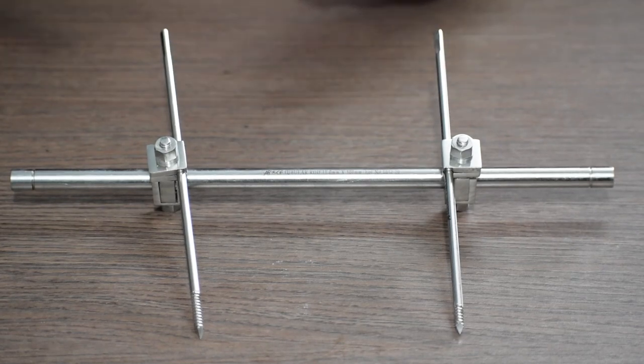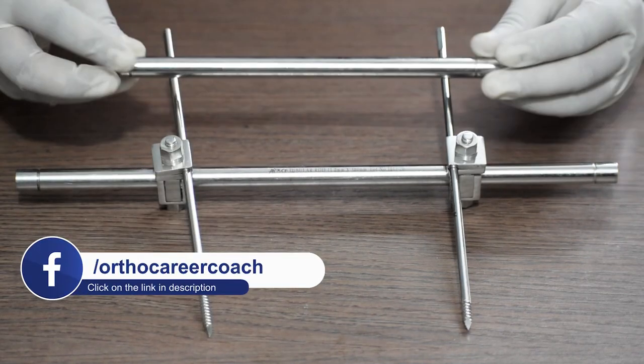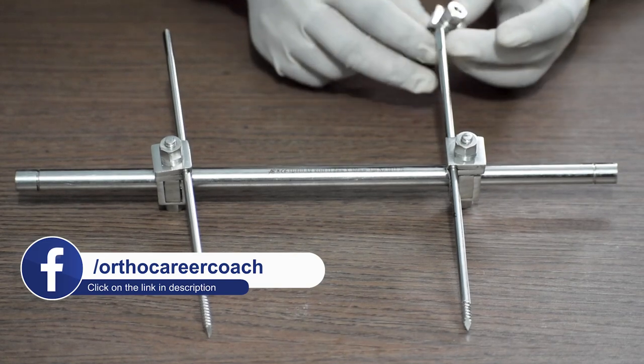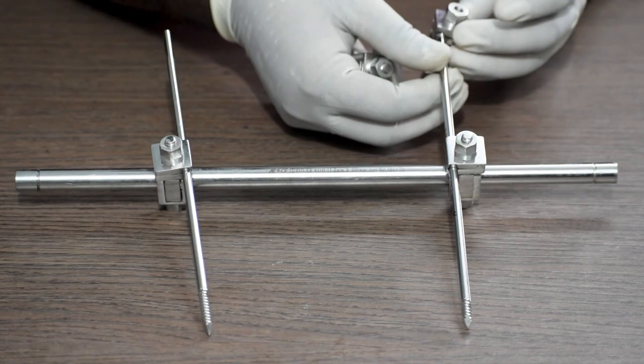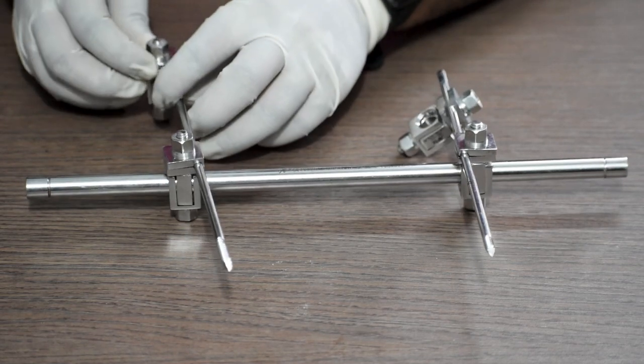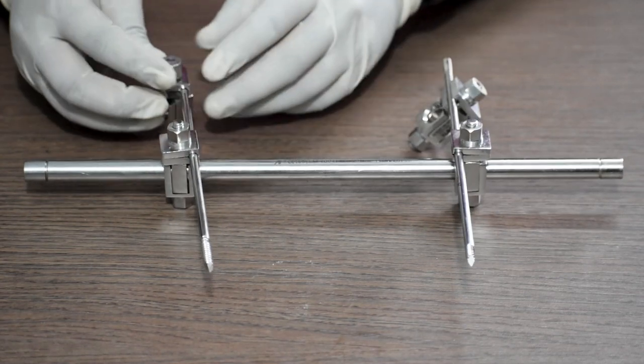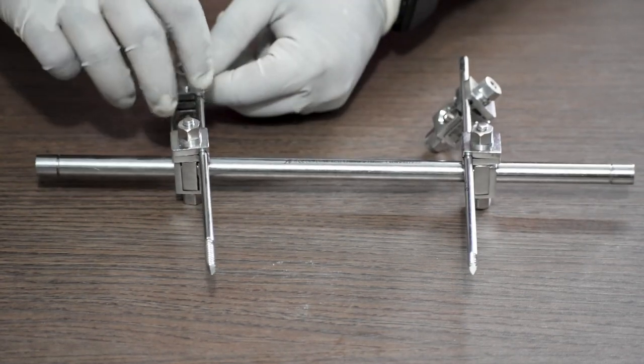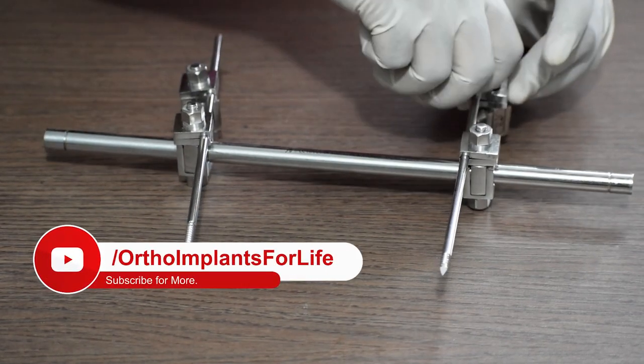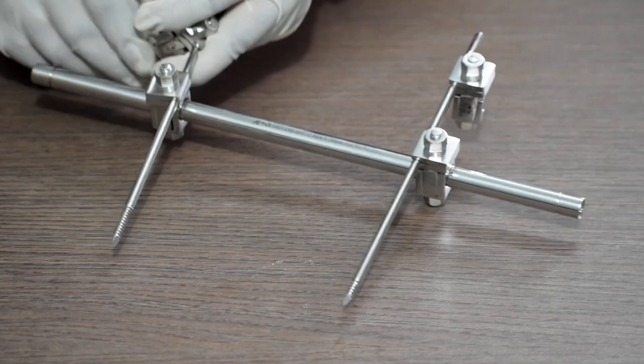In case we require to do a double rod fixation, we will attach two more single pin clamps and then we will insert the tubular rod through this single pin clamp.